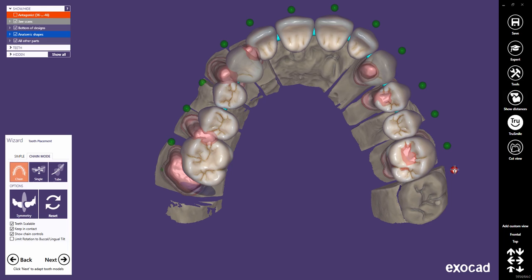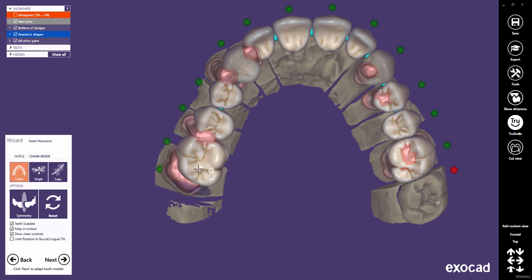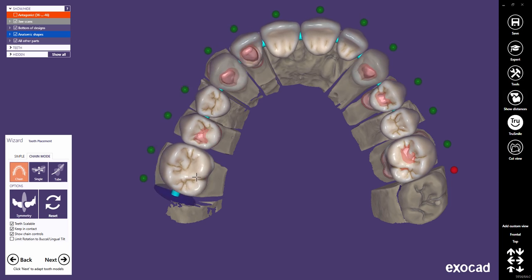That's why I recommend pinning the control point of the UFO once you have finished the placement. Now you can click and drag the chain at any point without changing the distal position of the pinned UFO.